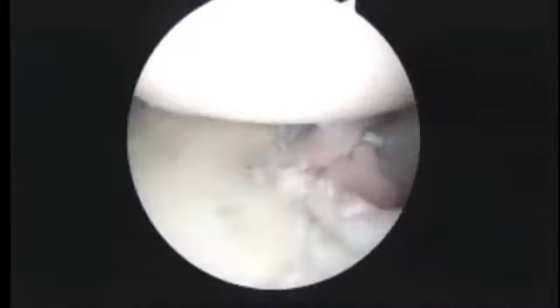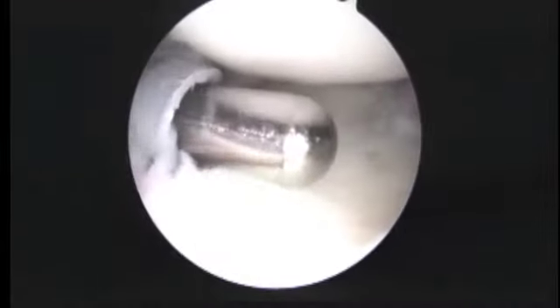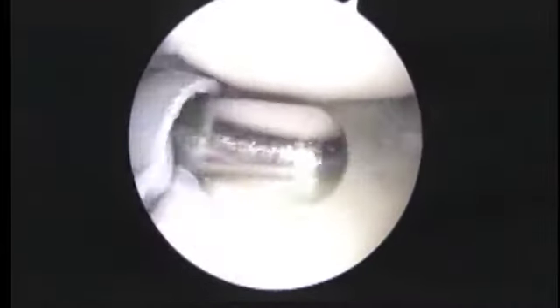We're done with the reconstruction in the front — that looks a lot better now. We've got all the sutures tied and a nice wall of labrum and capsule. We're going to have a look from the back to the front at the biceps tendon now.